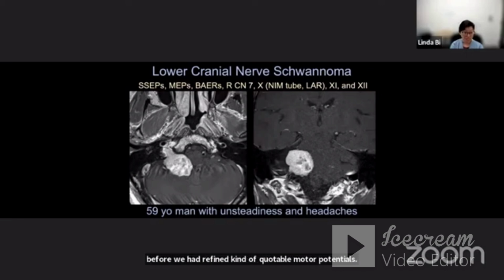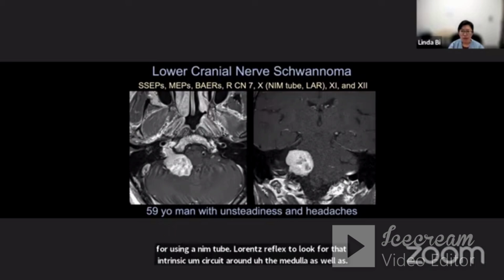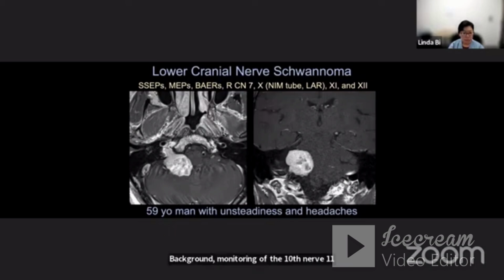I would do somatosensory evoked potentials, motor evoked potentials for the medulla being compressed, BAERs for the superior extension, monitoring cranial nerve 7 for the superior extension, and cranial nerve 10 using a NIM tube, with the laryngeal adductor reflex to look for that intrinsic circuit around the medulla, as well as background monitoring of the 10th nerve, 11 and 12. These days, we would also include corticobulbar motor evoked potentials for 10, 11, and 12, which can be fairly sensitive.